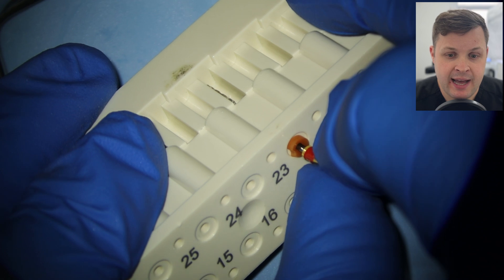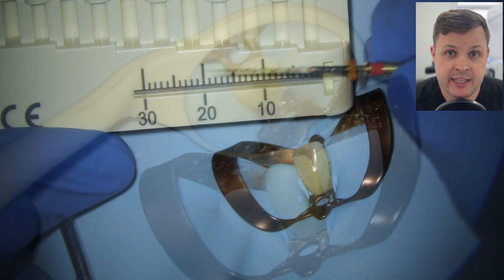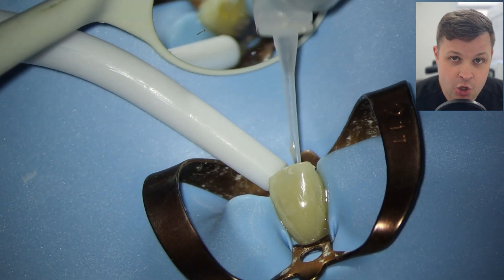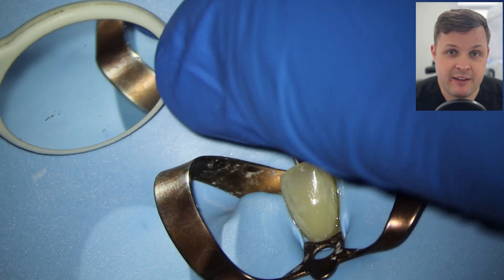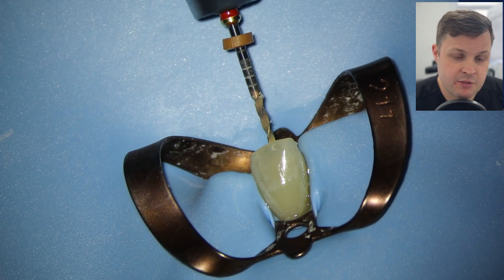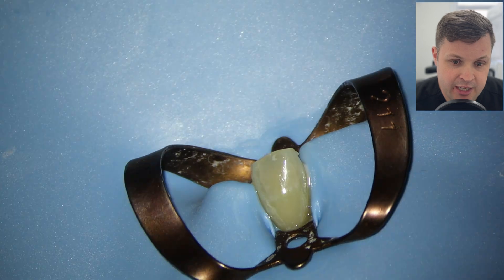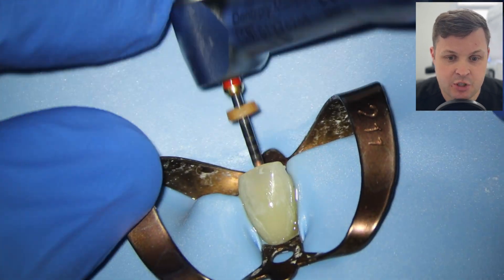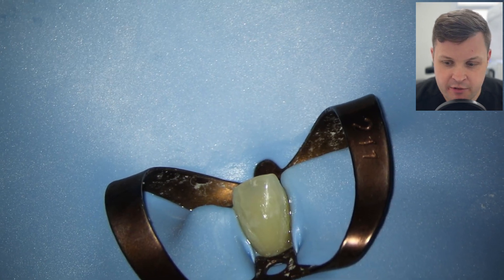We're ready to use our final shaping with a master apical file — a size 25 variable Hyflex — shaping the canal 0.5 millimeters away from the zero reading to account for the apex. We're getting a bit of resistance so we irrigate, recapitulate, then use the size 25 again to try to get to the zero reading. Some might argue going from a 15 to a 25 is too big a step, but I've had predictable results. In highly sclerosed canals I'd go from 15 to 20 then to 25. Lots of recapitulation and irrigation throughout.